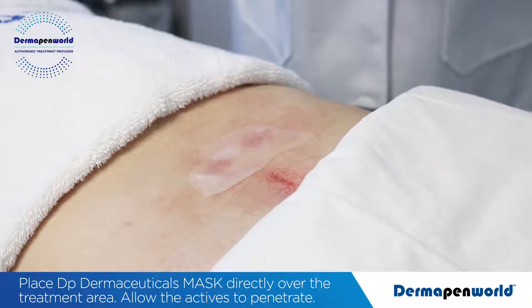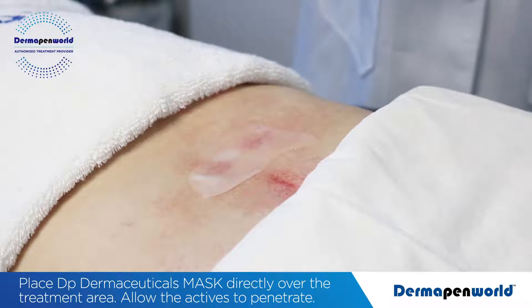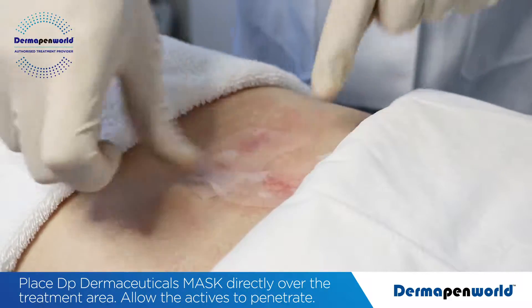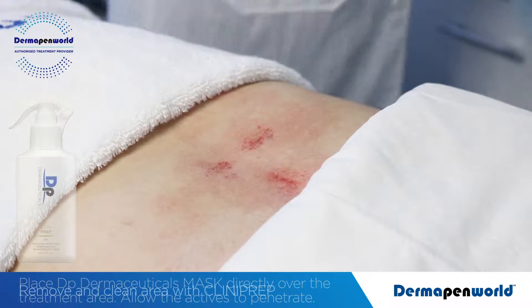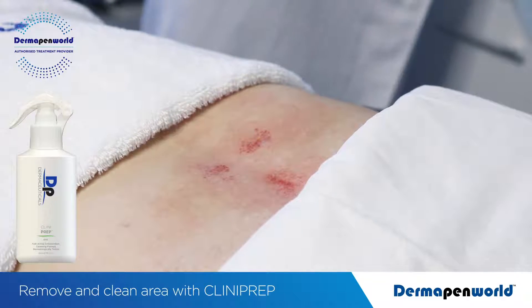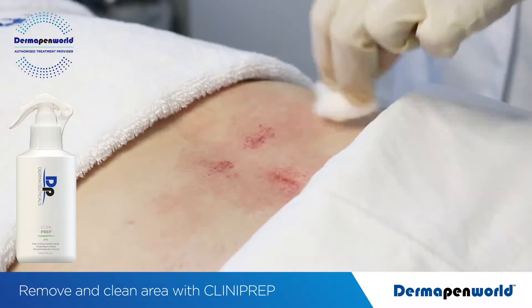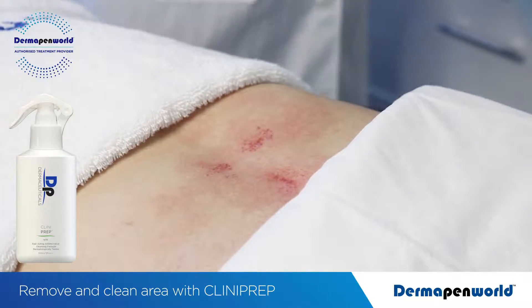This may be applied onto the skin for up to 7, 10 or 15 minutes post-op. Remove the Highlight Active 3D Sculptured Mask. Any residue can be dried up just by using some dry cotton. And now we follow with our post-operative care.